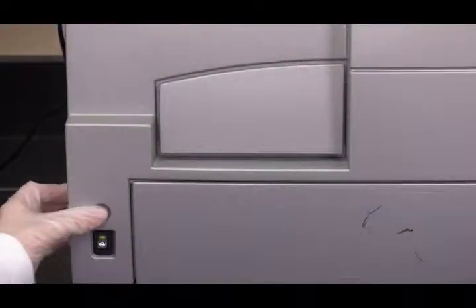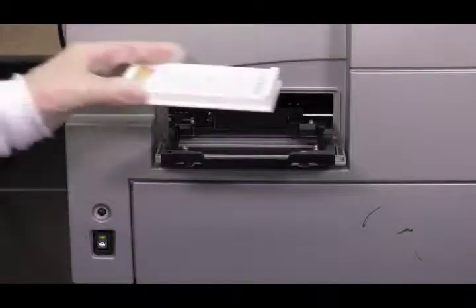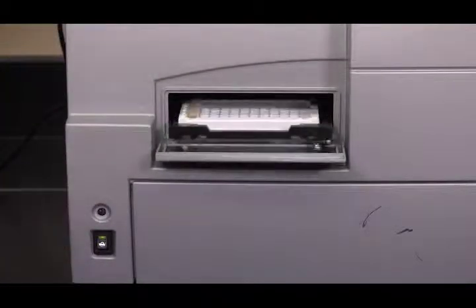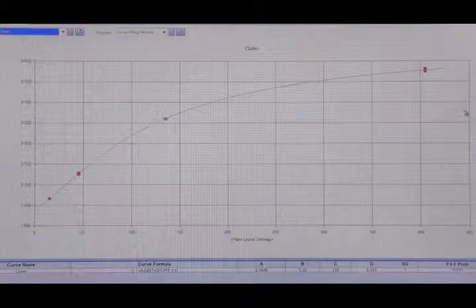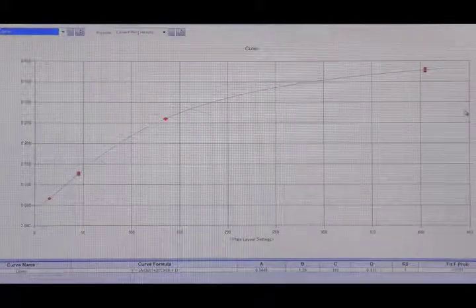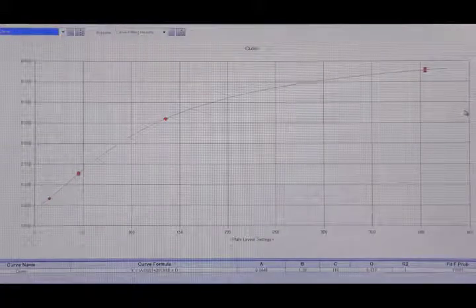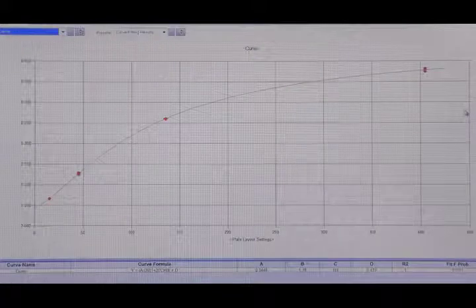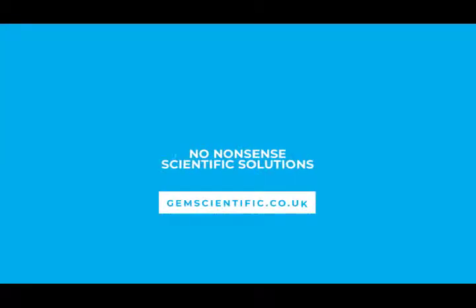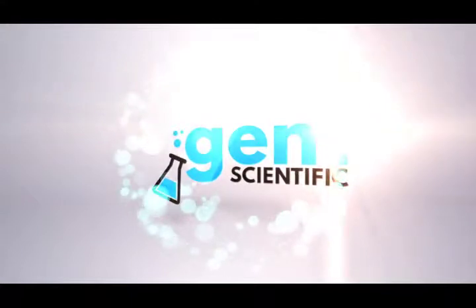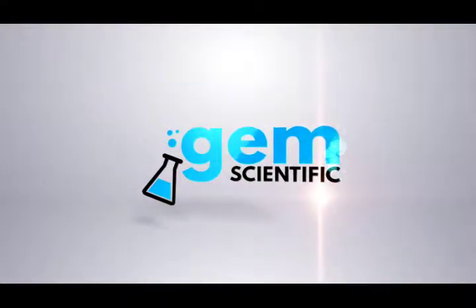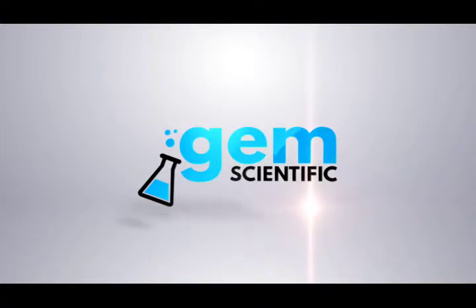Determine the absorbance at 450 nanometers within 30 minutes after adding the 3M Stop Solution. For complete result analysis instructions and minimum performance characteristics, refer to the Instructions for Use document for each particular assay.